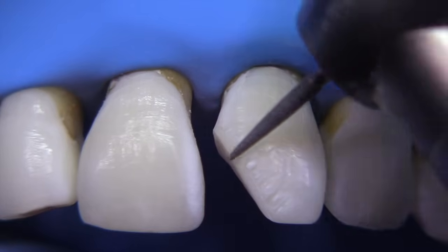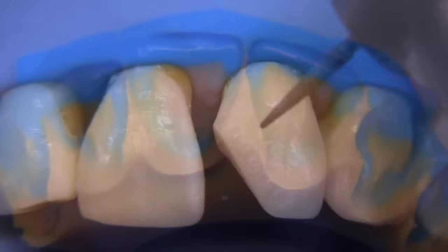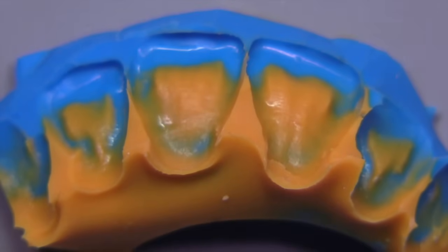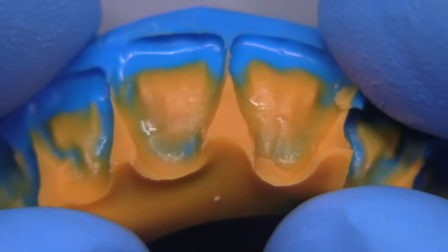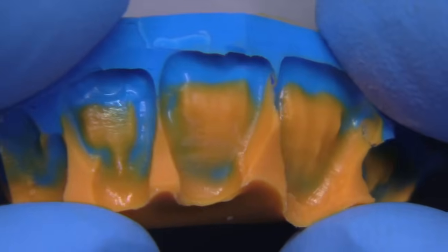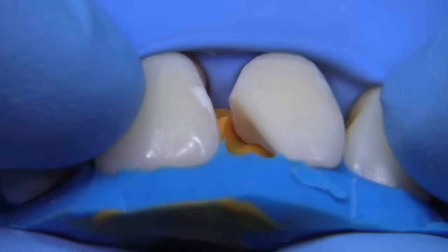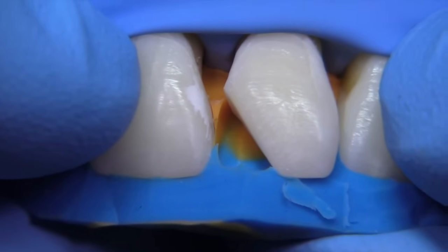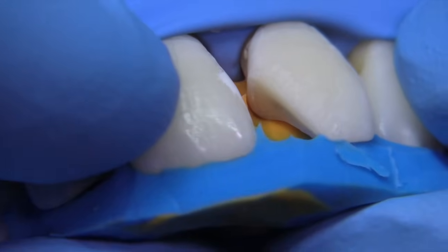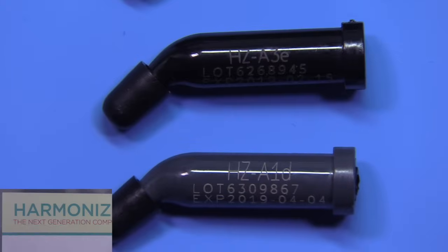Before I started, I went ahead and made a stent. Normally this would be made from a diagnostic wax-up of your Class 4 fracture — you can quickly pour it up, do a quick wax-up, or have a laboratory help you. I utilized a very accurate material so it fits intimately. A lot of people make these too quickly without enough concern for accuracy. The more accurate you are, the better your morphology will be on the lingual.